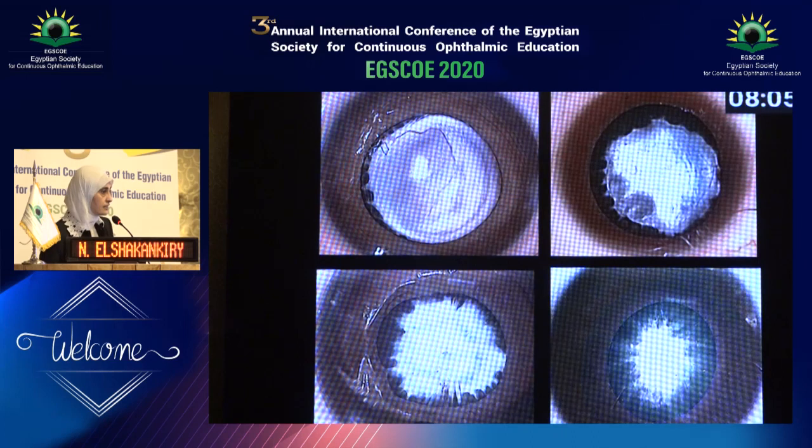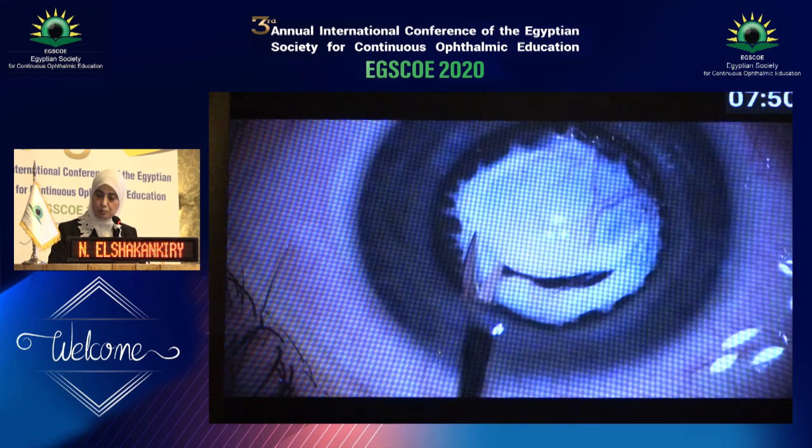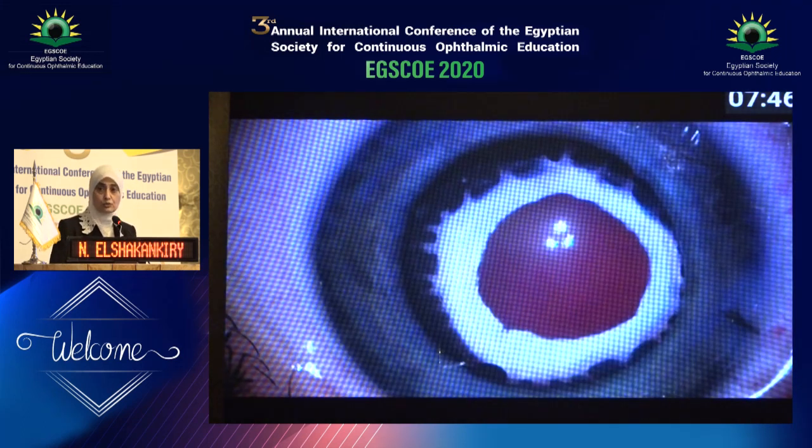And it may be affected with a variable degree of ciliary processes prominence, as a mild prominence, or moderate or severe prominence of the ciliary processes. During surgery, after irrigation aspiration, we cut the membrane and then we eat it up with a cutter. We used to do this in the past.